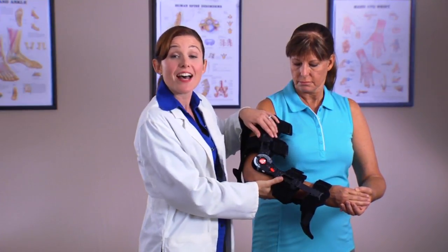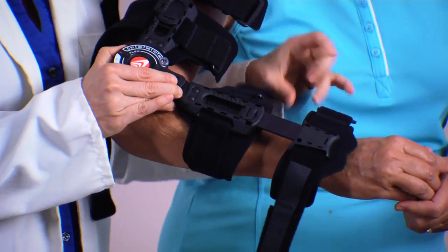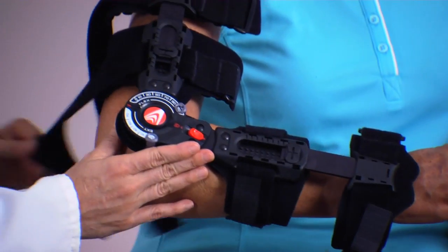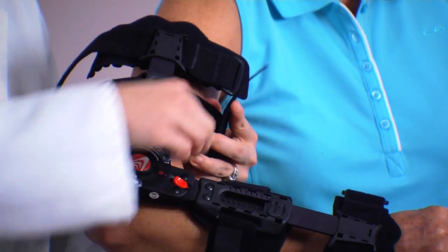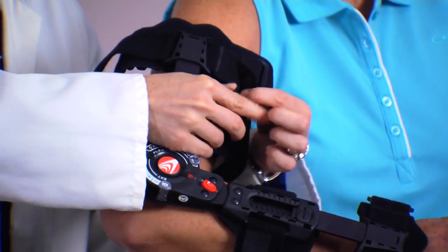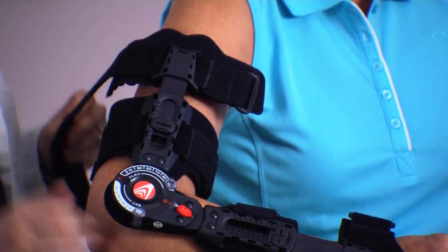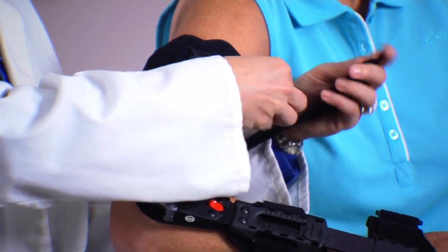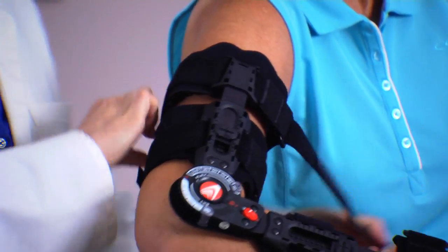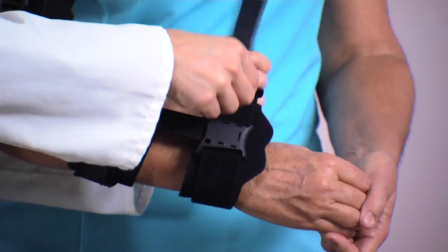Then, while supporting the injured arm, fasten the forearm strap closest to the hinge by inserting the strap through the D-ring, pulling it tight, and then attaching the velcro piece to the strap. Fasten the arm strap closest to the hinge. Then, fasten the upper arm strap furthest from the hinge. Lastly, fasten the strap closest to the hand.